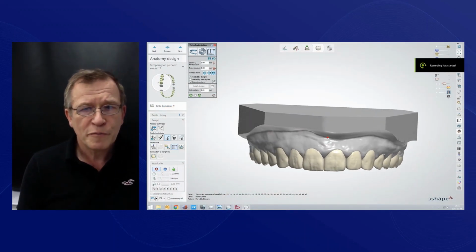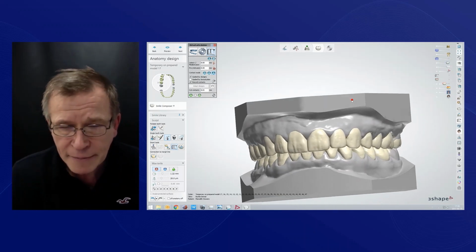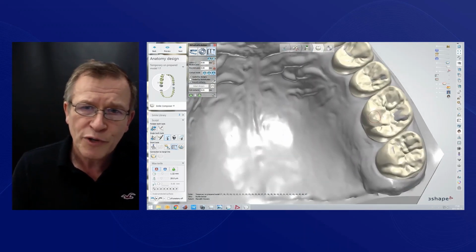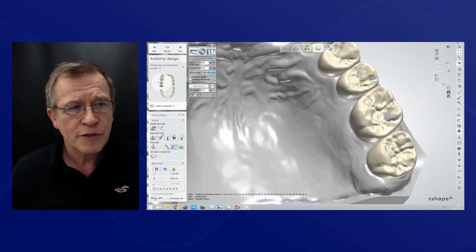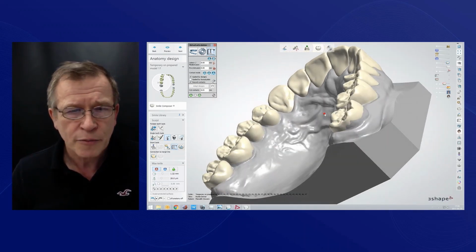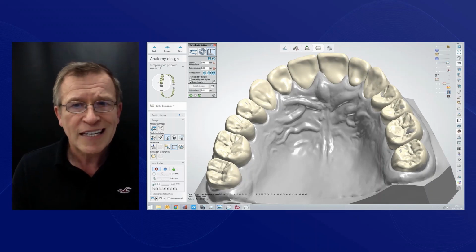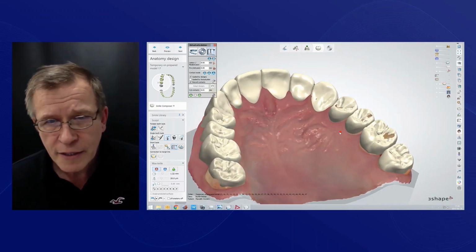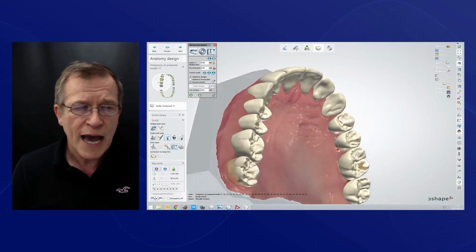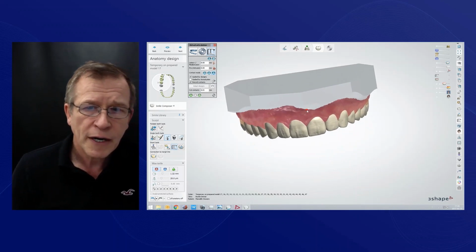Now, once we moved on from splint therapy, I wanted to give Meredith a bite that was going to be stable for her. I didn't want to move straight to porcelain because I was concerned that she had some problems with her joints that were now stable, but I wanted to make sure that that stayed stabilized with the restorations. So we wanted to go to an additive mock-up so that I could make individualized temporaries for her.